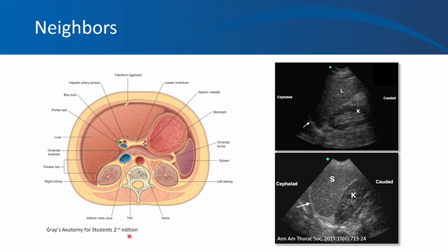And on the right, the liver extends more anteriorly. So the right kidney can be visualized easily through anterior or lateral imaging planes. On the left, the spleen is more lateral. And if you go more anterior, you'll encounter bowel gas. So the left kidney is better visualized through the lateral aspect.